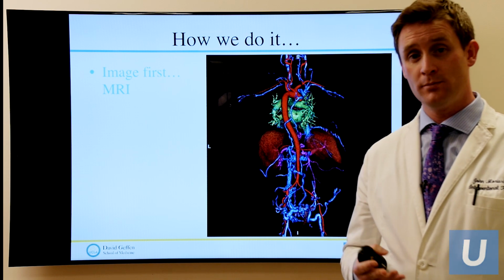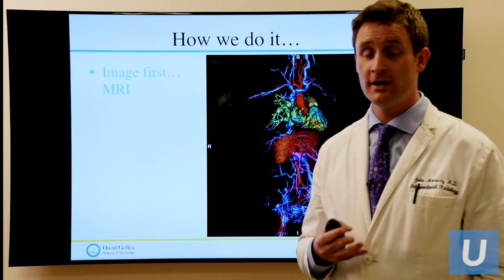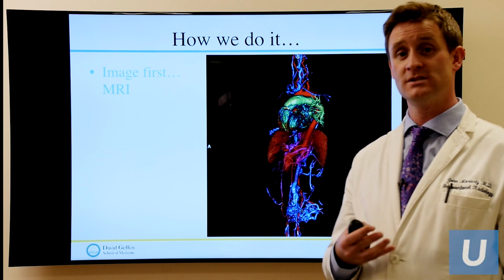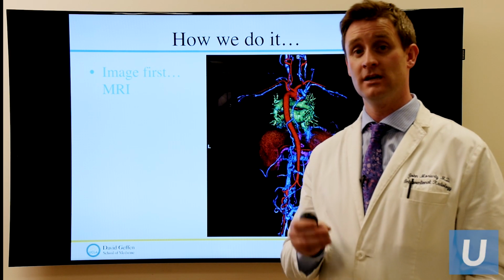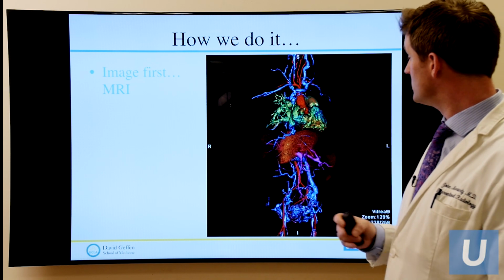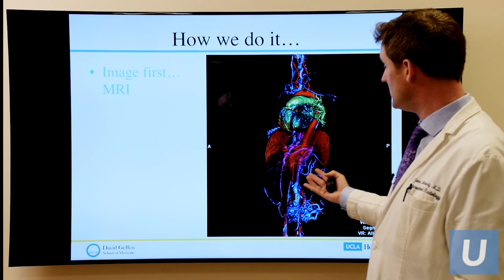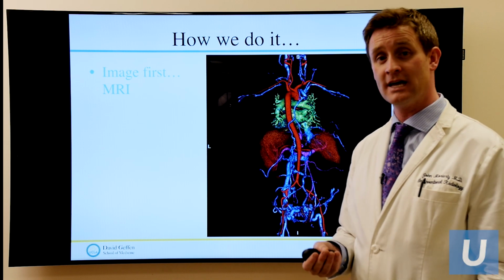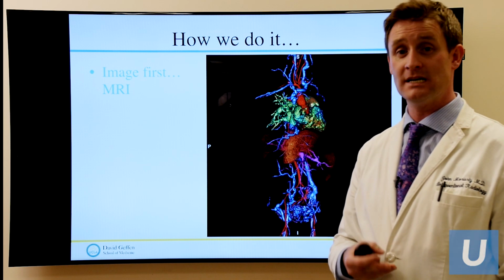We can also do an MRI. Paul Finn is a world expert in MRI of the veins, and he works very closely with our group, and his group have developed many novel techniques for this, so that now we can use MRI to see these sorts of clots that are developing anywhere within the body using no radiation and a minimum of contrast that could be potentially damaging to any other part of the body. And you can see here we're able to develop these 3D road maps of the veins, of the arteries. Here, rotate them around, coming up through the body, up to the heart and lungs, so that we're able to get a very good idea as to what your risk might be, and if we need to do any intervention, what the best way of doing that would be.